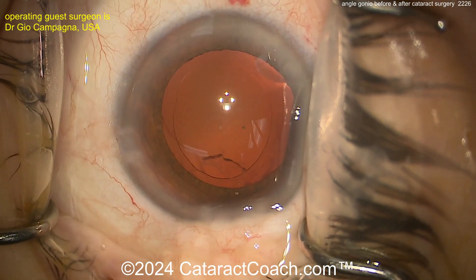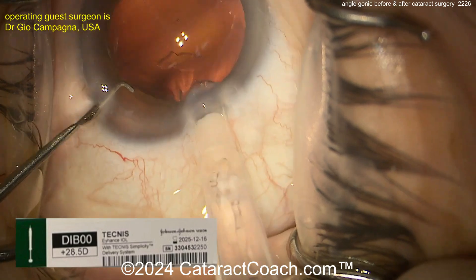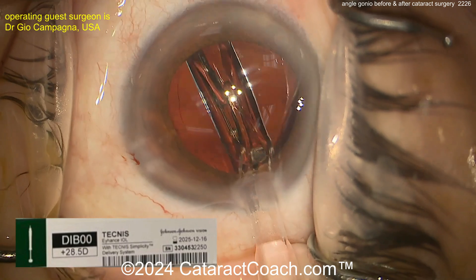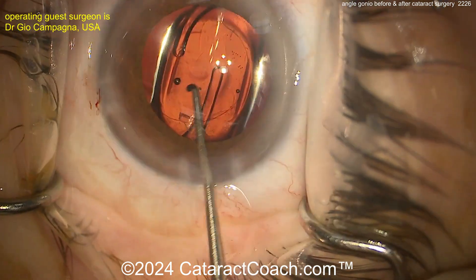There we go — get some viscoelastic in the back and put the IOL in. Looks like a single-piece acrylic lens. Get that nicely delivered — 28.5 diopter. So you have a very high-power lens. The patient is obviously hyperopic, with a shallow AC and short axial length, requiring a 28.5-diopter implant.